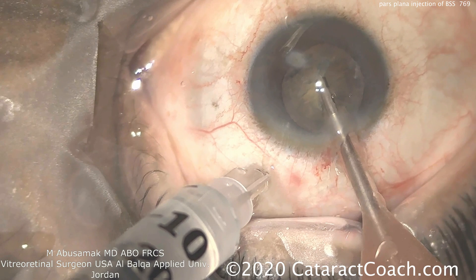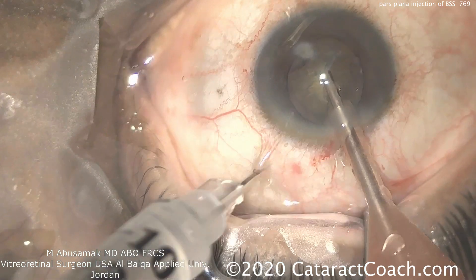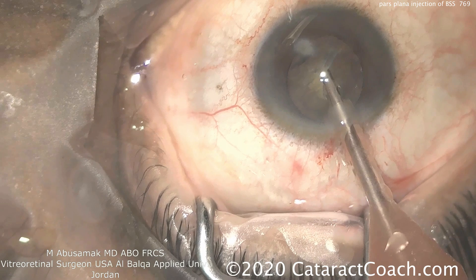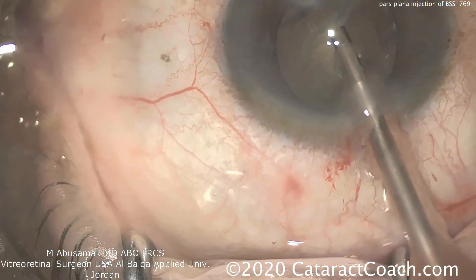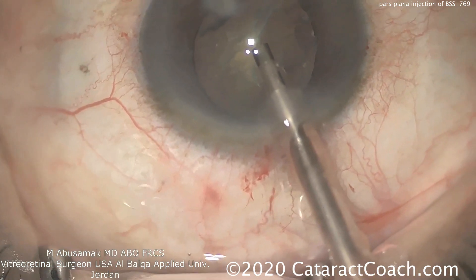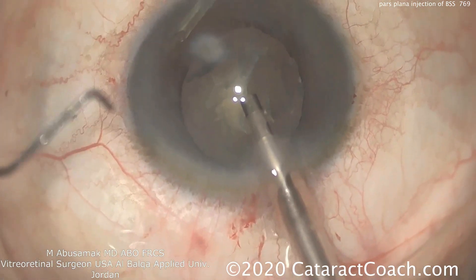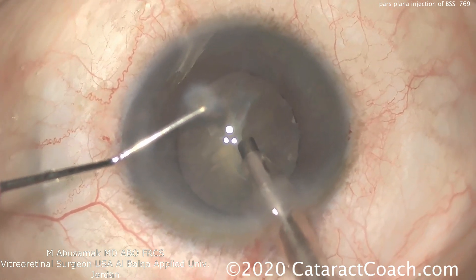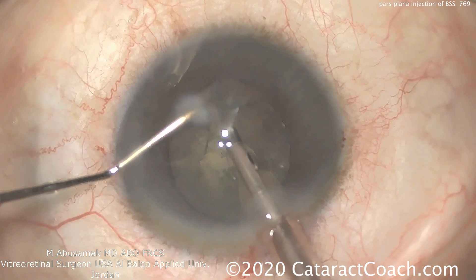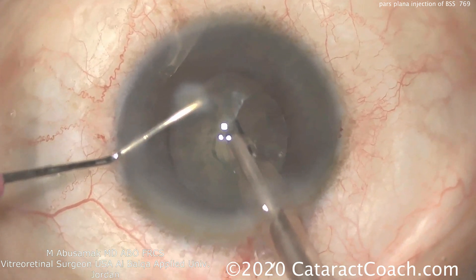Dr. Abusamak is also retina trained and he trained here in the U.S. as well, so he has a lot of expertise in this area. Certainly doing a pars plana injection is not a significant challenge for him. The anterior chamber has been restored to a more normal anatomy, and now the rest of the surgery can proceed normally.